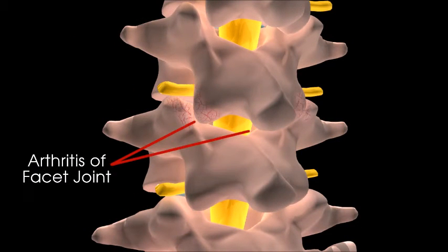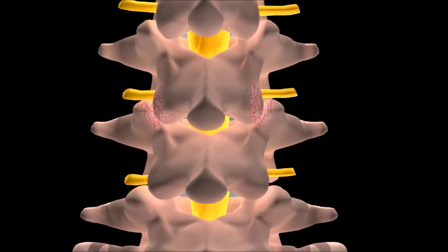A facet joint injection can be helpful in diagnosing and alleviating back pain associated with facet joints. Dr Krishna is highly experienced in performing lumbar facet joint injections.